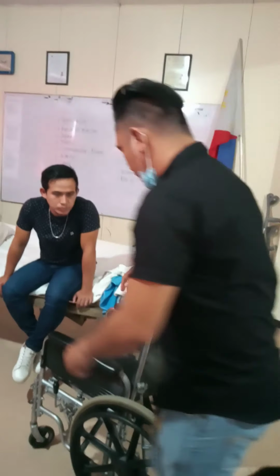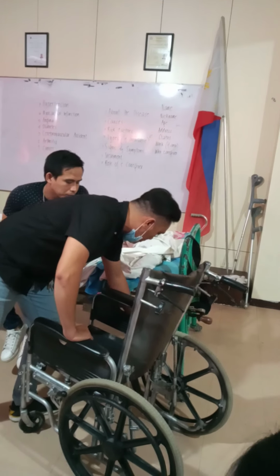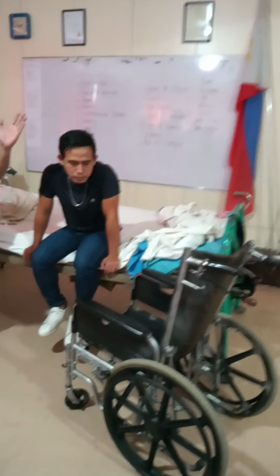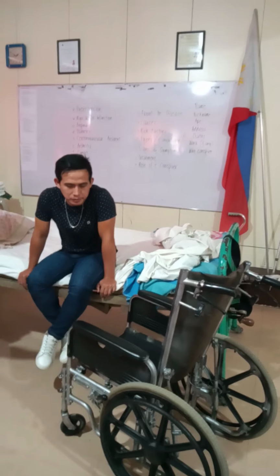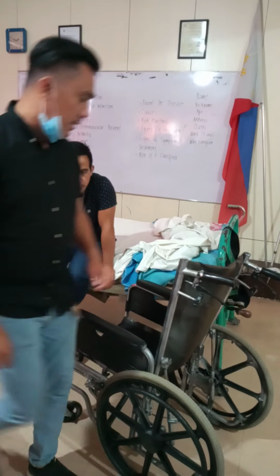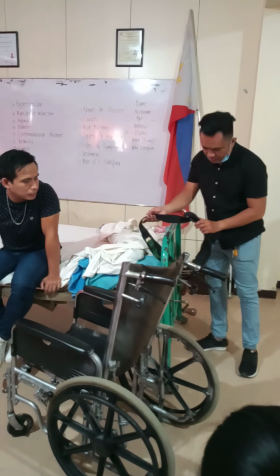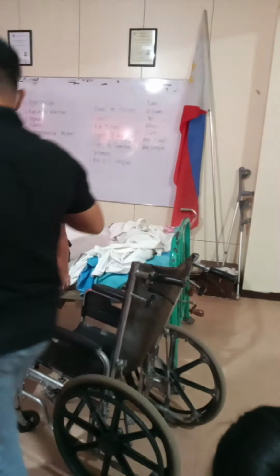So once the wheelchair is in a position, then lock both wheels. Okay. Then footrest should be at the side. Kato footrest same sa kato kanana quad wheelchair. Then prepare your patient na yun. Okay. Now for the patient, you should be using gait belt para dali na nimo siya pa para good. Sir, gamit ang gait belt.